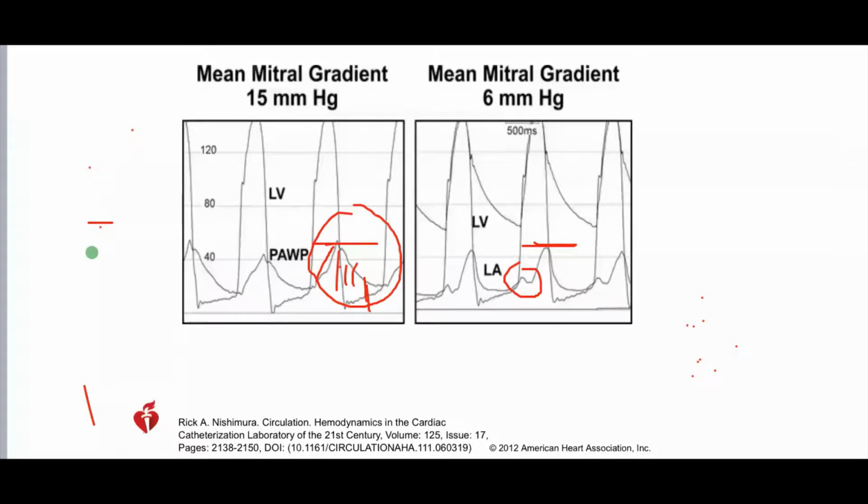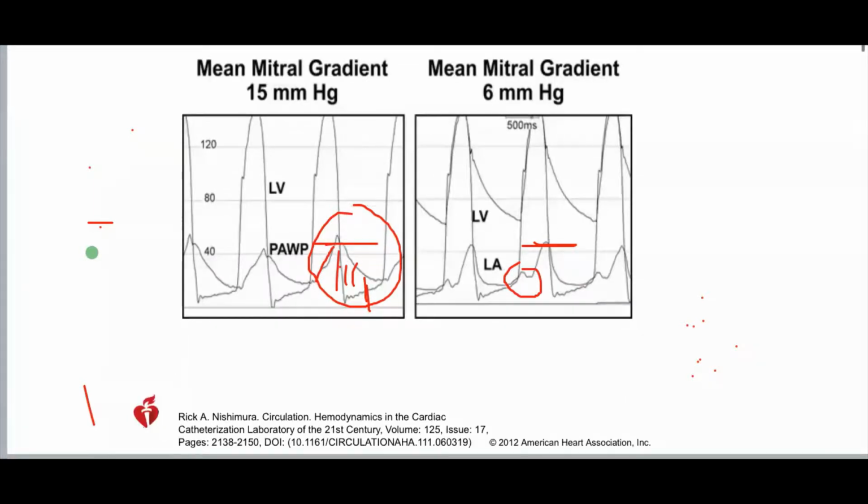If you push the wedge back into the right place, you will eliminate that gradient. The wedge will overestimate the gradient erroneously because of this time delay if you are not careful enough to adjust for it. Okay? So this is important. I wish you get this point clear. Good.